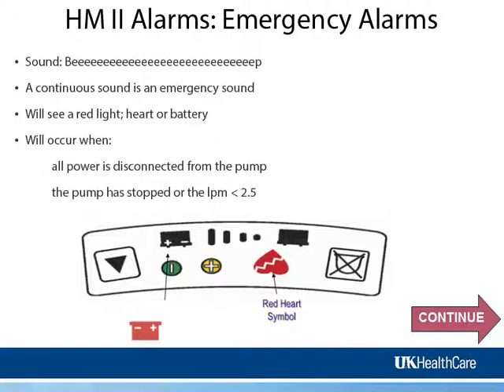If the controller makes a continuous and loud shrieking sound, this alerts the patient that emergency action is required. In most cases, both batteries have been disconnected or the power source has failed. The result of a power failure is that the pump will stop, and the patient will immediately become symptomatic.